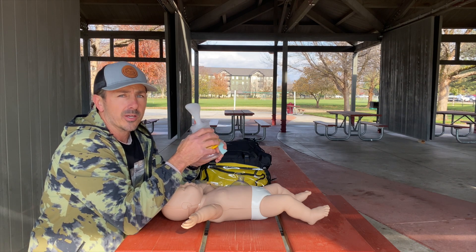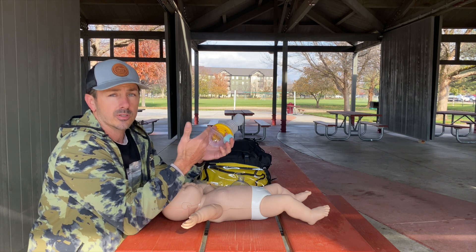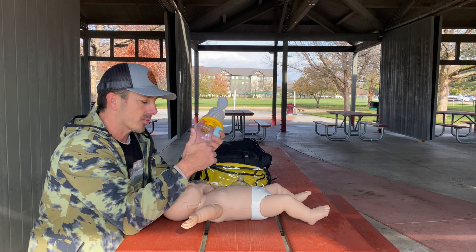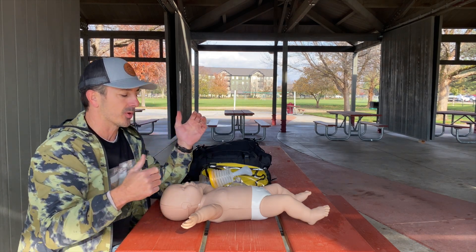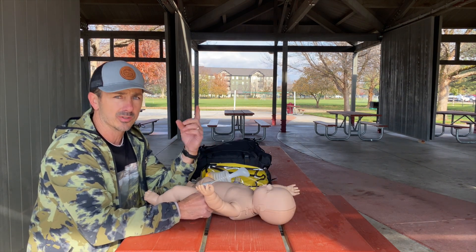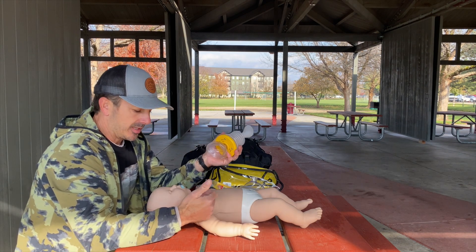At this point, maybe the baby starts crying — that's good. Make sure you get the baby to the hospital and have them evaluated by medical professionals. If the baby does not wake up and start crying — in most videos where this is used the baby does wake up — but if not, we're going to go into traditional CPR. That's 30 compressions to two breaths, or two-thumb technique for infants. We'll link the videos to our infant CPR sessions.